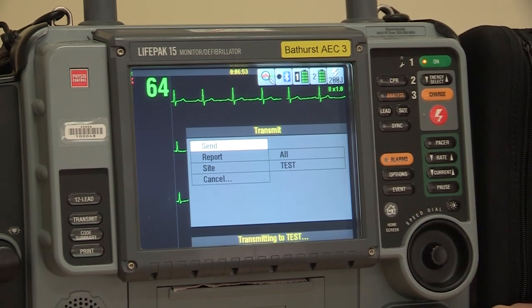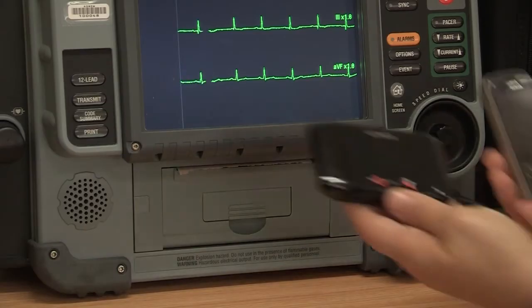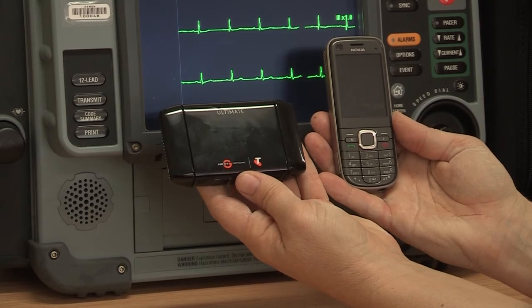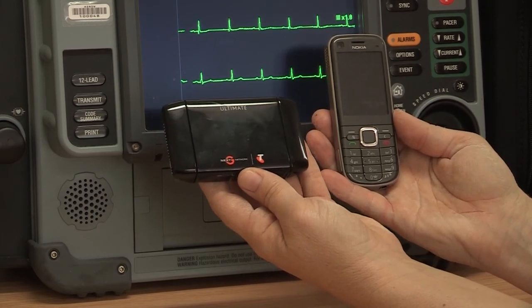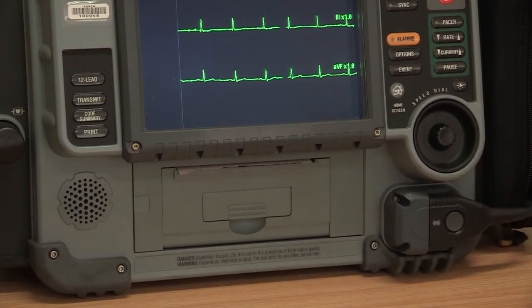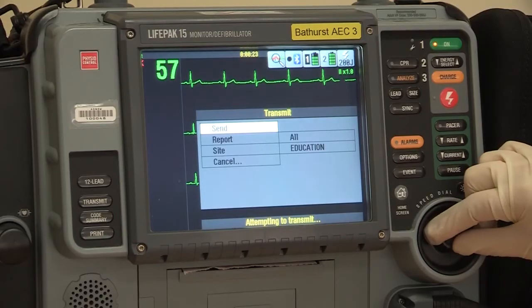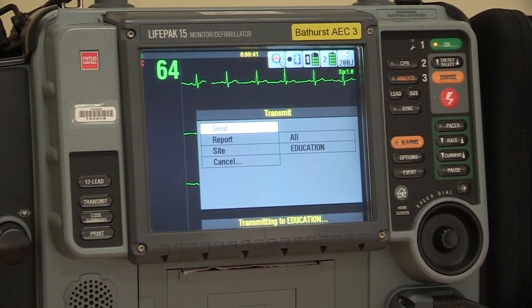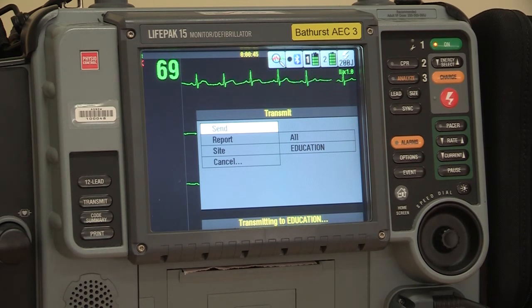If you do not have an onboard modem, connect your USB or phone cable, which allows the transmission to happen via the gateway function, and follow the above steps the same way. The machine will show 'Connecting' at the bottom of the dialog box. After connection takes place, it will show the data uploading. This may take a couple of minutes, so be patient and don't press any other buttons.